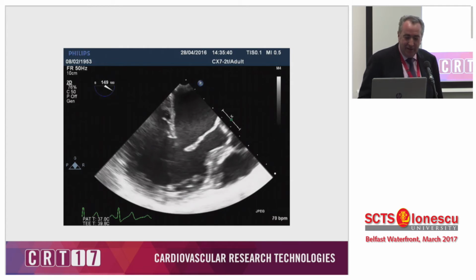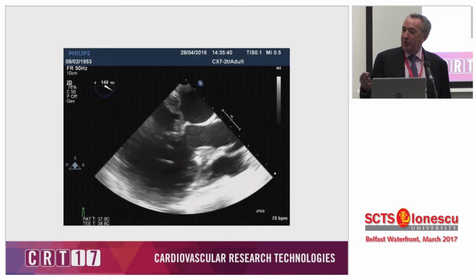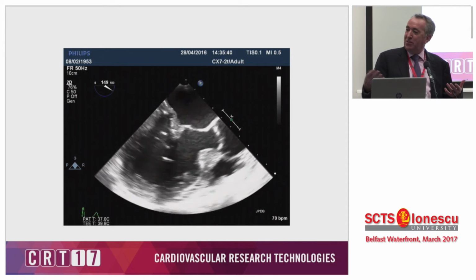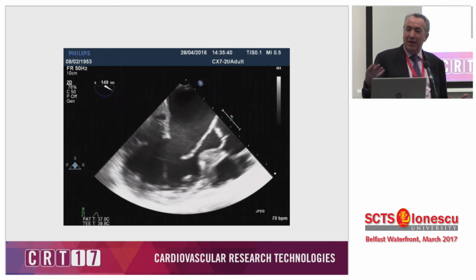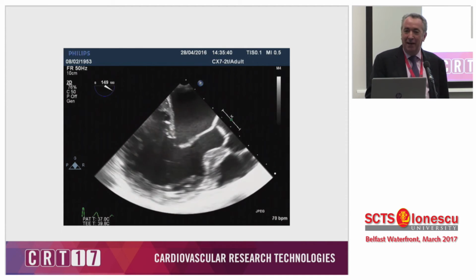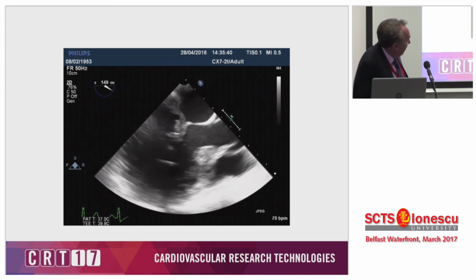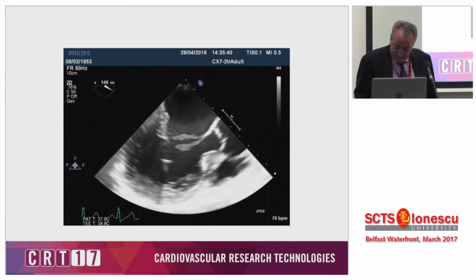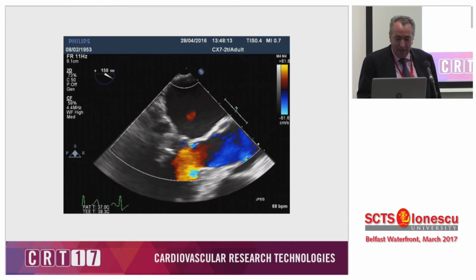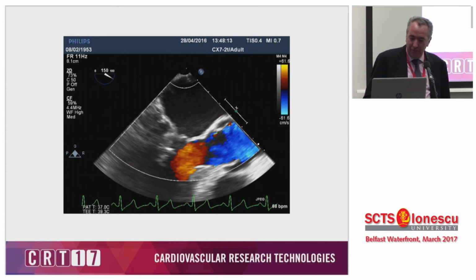And again, it's very simple. You pull it down. I think one of the fascinating things about this for us surgeons, we operate on still mitral valves and try to visualize what they're going to be like. Here you have the mitral valve working, and you pull the cords down until you think you've got a nice repair. And you can see here, obviously you can see the cord affecting this leaflet. I think you see it's a pretty good result.